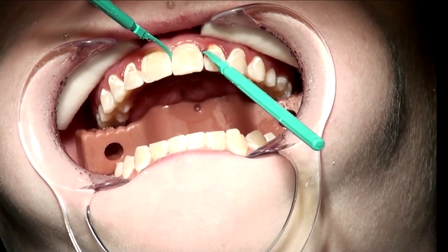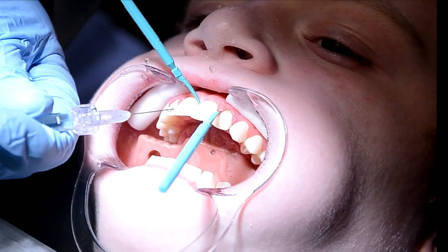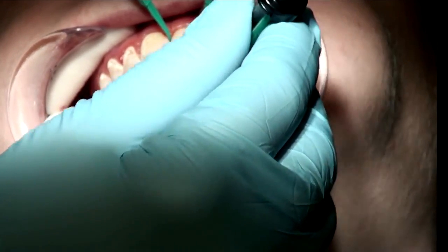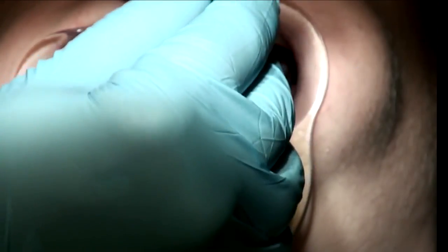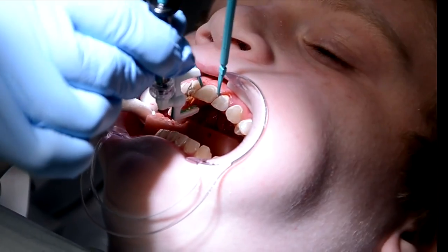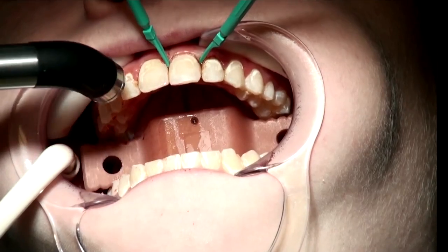The next thing you do is take ethanol, which is a drying agent, and this is applied for 40 seconds. The Icon is a yellowish liquid that's somewhat viscous. It does not have any fillers in it, so it does not appear radio-opaque. The Icon applicator makes it easy to floss in between the teeth and deliver the material right where you need it. Light cure for 40 seconds.